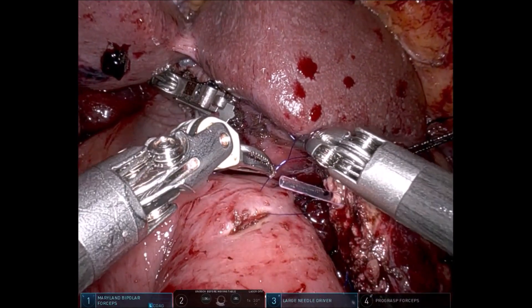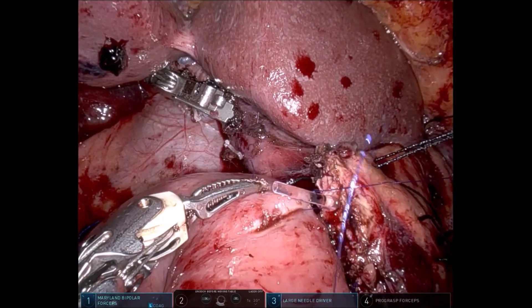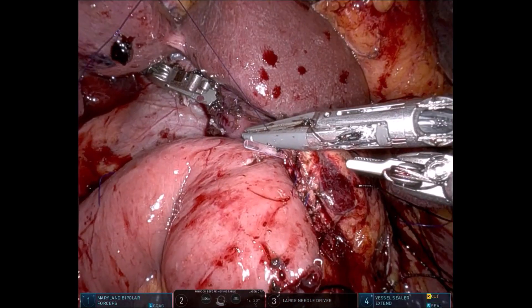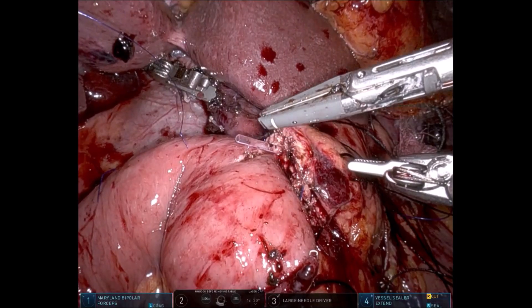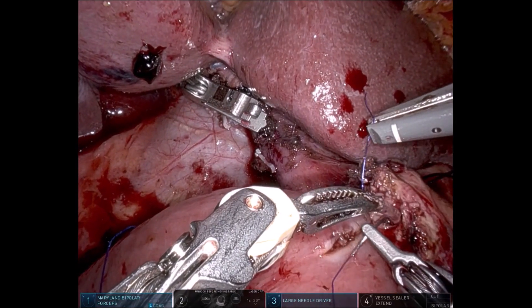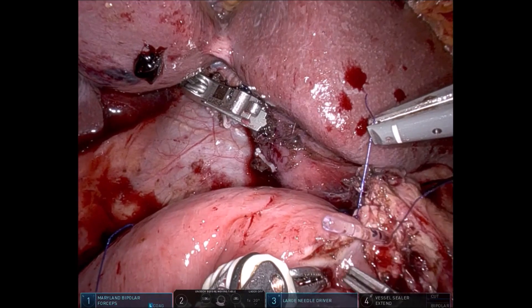The first stitch is taken in the posterior corner, approximately at the 8 o'clock position. The 6 French tube is around 2 millimeters. Since we don't have a needle holder with an inbuilt scissors, we use the vessel sealer for retraction and cutting purposes.